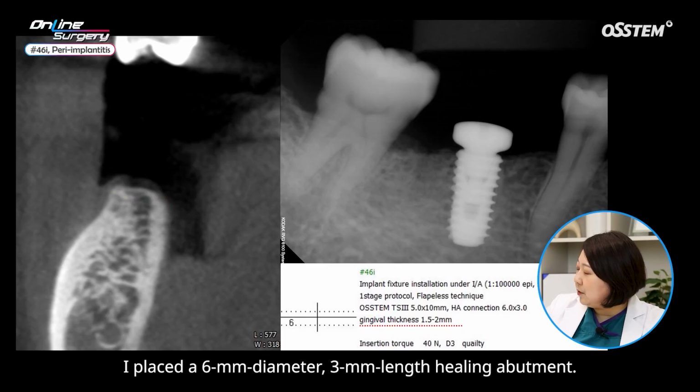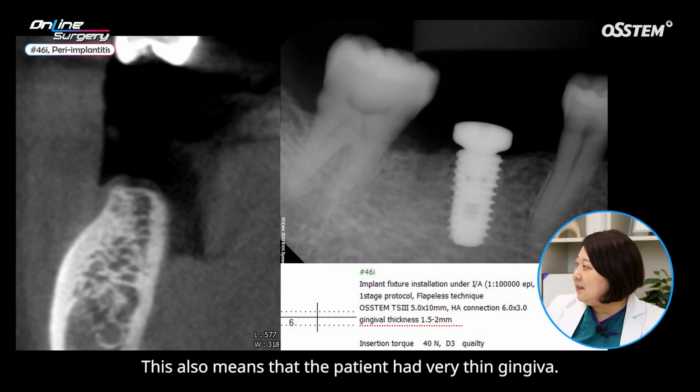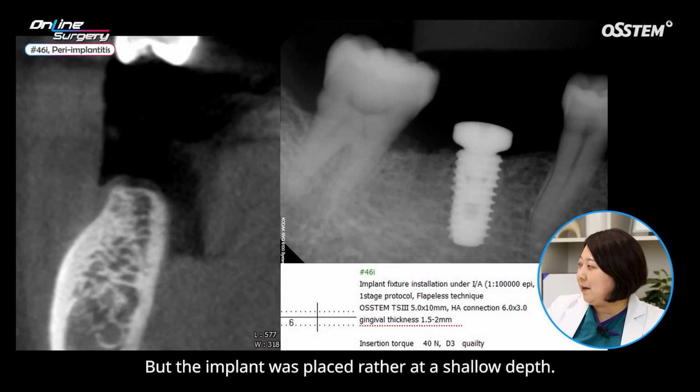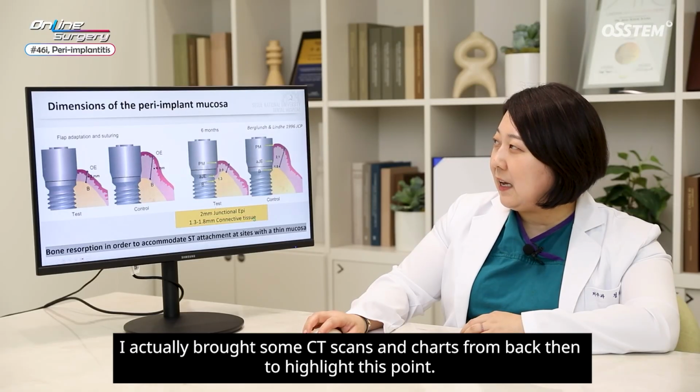I placed a 6 mm diameter, 3 mm length healing abutment. In usual cases, an abutment with a length of 4 or 5 mm is used instead of a 3 mm one. This also means that the patient had very thin gingiva, but the implant was placed rather at a shallow depth. I actually brought some CT scans and charts from back then to highlight this point.